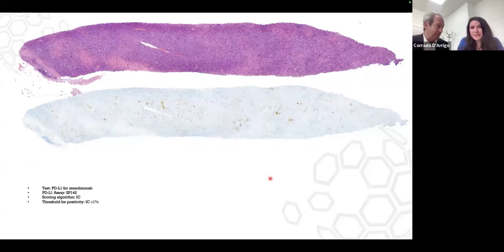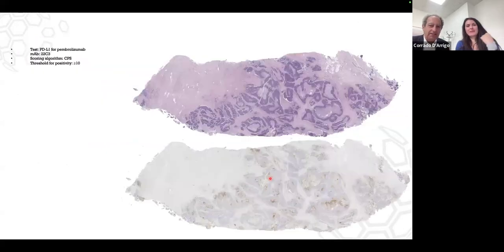I have to say, it's probably my favorite PD-L1 marker. 22C3 is a devil because you may not see much at times 10 or even times 20, and then you put a higher power and you think, oh, look, there is staining in the immune cells. And that's also a larger piece of tissue, and you can see how well you see the staining.